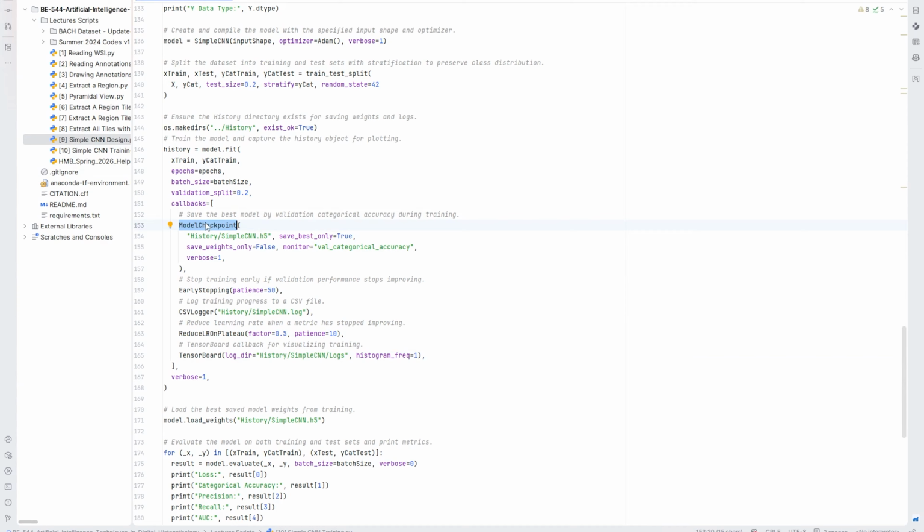So let's say we are iterating for 10 iterations. This callback will test if this iteration is better than the previous iteration or not. If so, keep it as the best checkpoint. If not, ignore saving it and storing it as the best checkpoint. It will do the same for all of the iterations, aiming to find the best checkpoint among them.